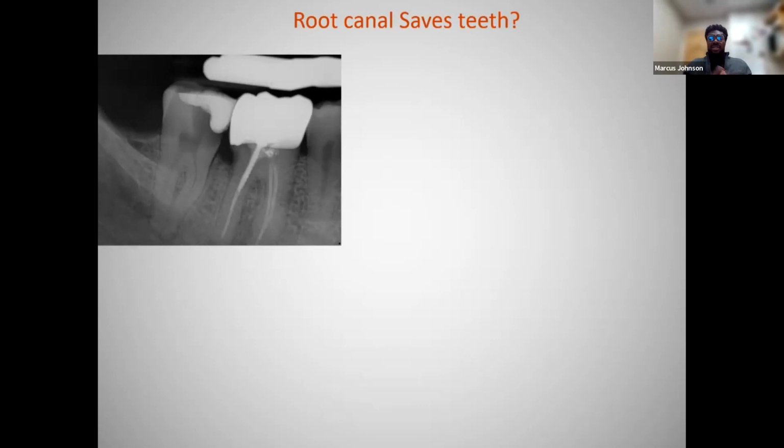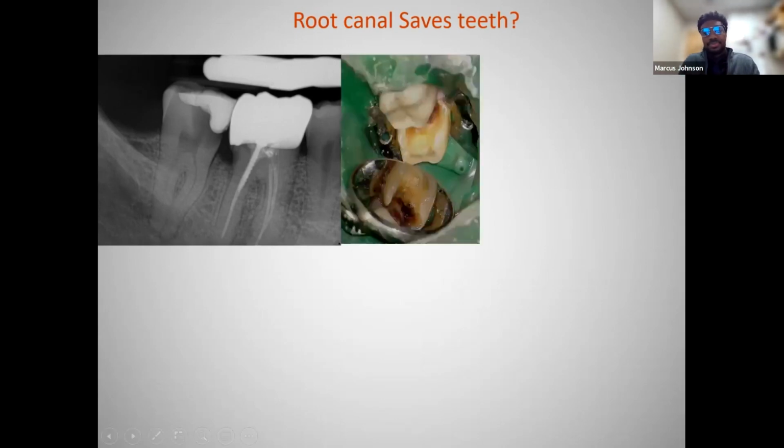Another case. Patient comes in, tooth number 31, extreme pain. I mean, we're so close to the IAN, the guy was just hysterical. Hey, doc, you got to get me out of pain. This is killing me. Love documenting my cases under isolation. You can see just the gross caries direct into the pulp chamber.